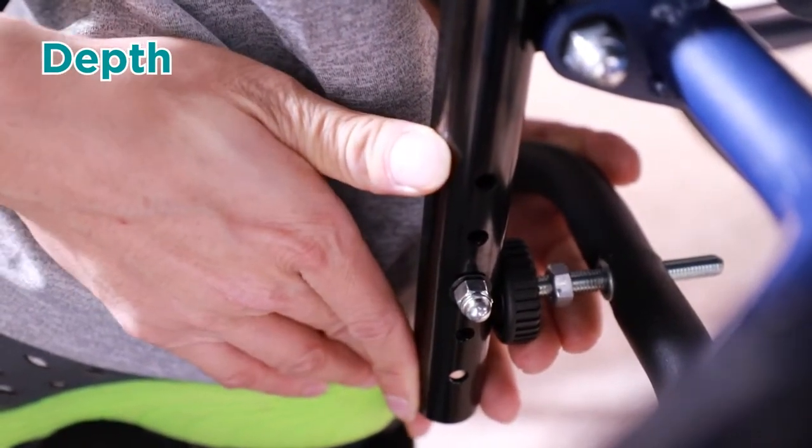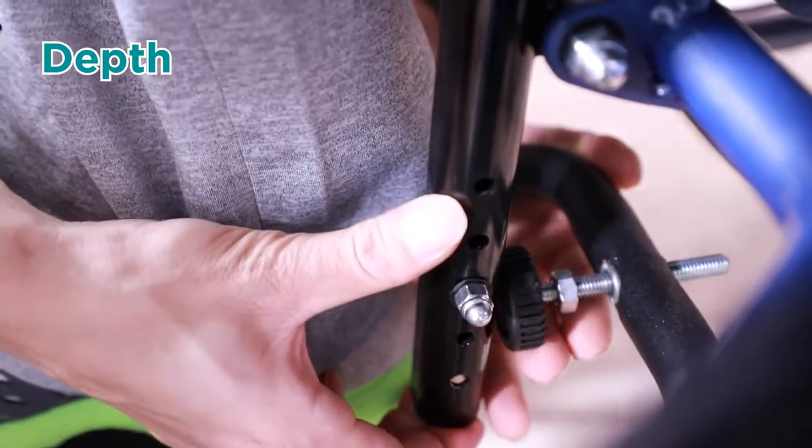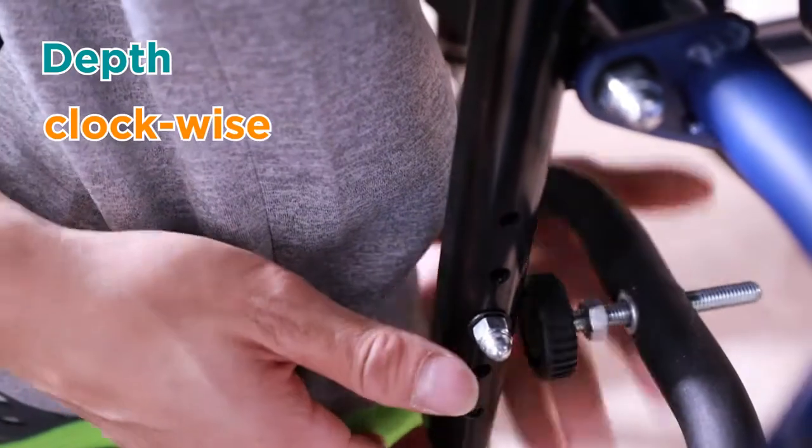On the other hand, if I want the knee pad to be placed further from the user, I will screw the bolts clockwise like this.